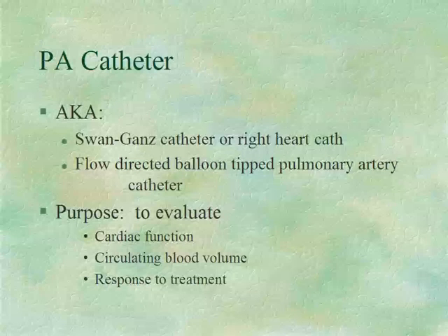which is about the same thing as your central venous pressure. To do your cardiac output, you need to use ice saline if your patient's cardiac output is abnormal. Some of the new equipment says you don't need to do the ice saline unless your patient is critically ill.